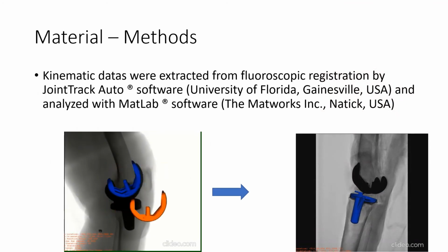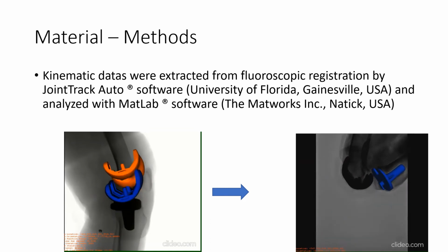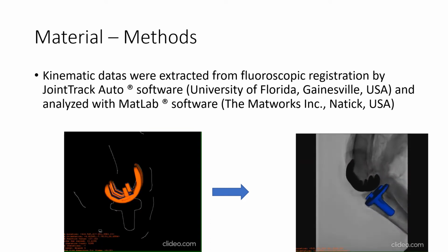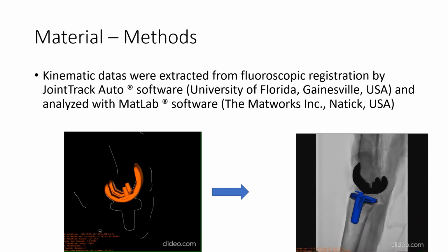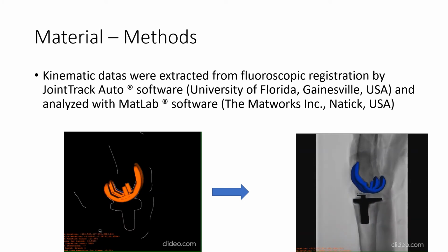Kinematic data were extracted from fluoroscopic registration by the JointTrack Auto software from the University of Florida, and these data were analyzed with the MATLAB software from MathWorks Incorporated.